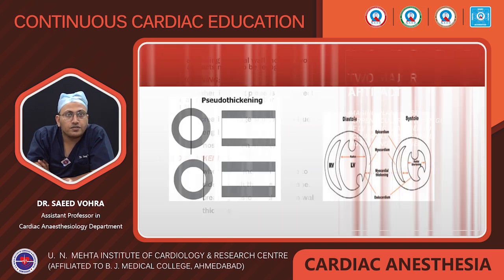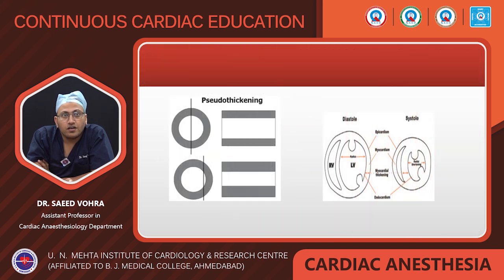This is the pictorial depiction of the pseudo-thickening. If the heart moves from side to side, one will have a false impression of increase in thickness of the LV wall.